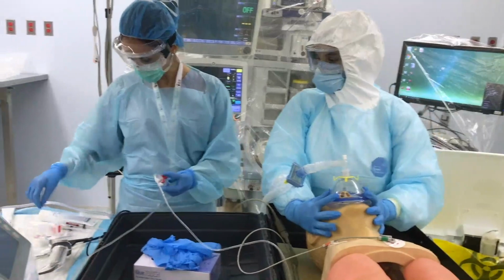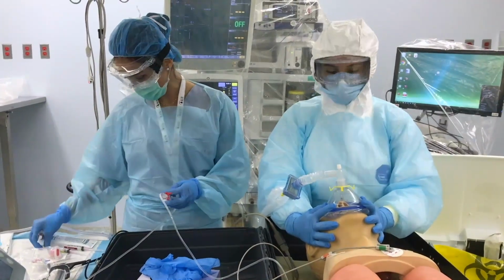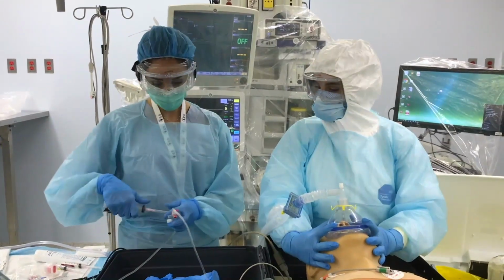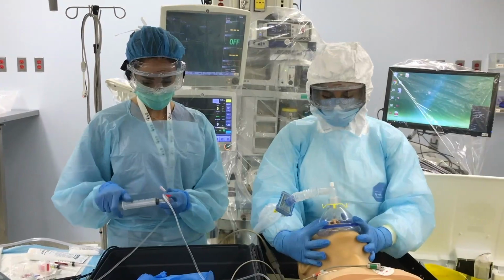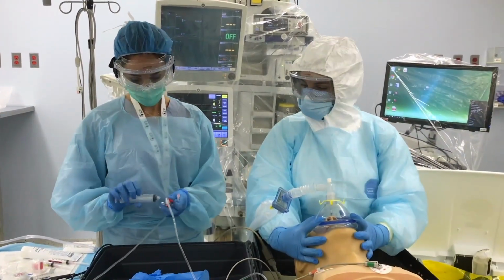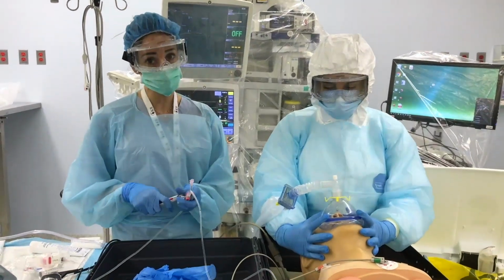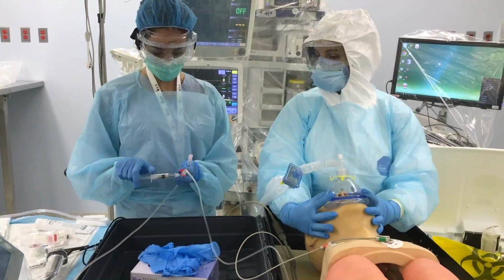We start by giving the medications after 5 minutes of pre-oxygenation. We try to do 5 minutes of pre-oxygenation with low gas flow just to decrease contamination as well. So I'm going to start giving the propofol, and then we're going to do 1.5 milligram per kilo of lidocaine. I'm going to give you the rocuronium. And if you need to give opiates, it's preferable to give them after induction, after paralysis, just to decrease the risk of the cough reflex.